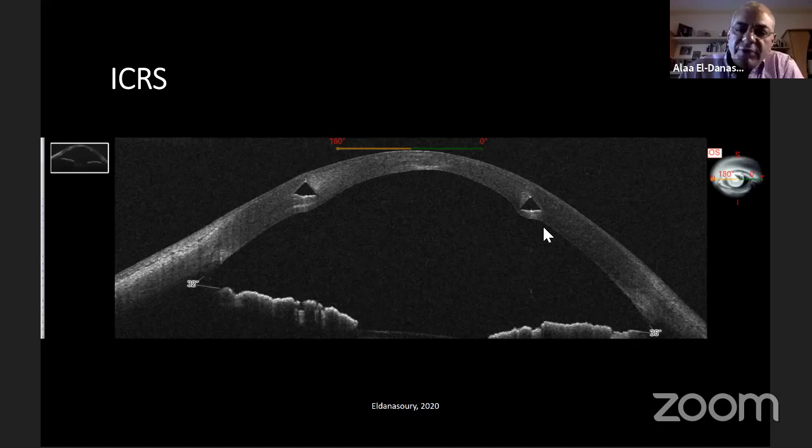In this case, for example, you can tell that the surgeon here, which is myself, did not do a good job, because the ring is kind of superficial as compared to the other rings. So in order to achieve good results, you need to have symmetrical placement, like in this case, for example. Now, but what I want to draw your attention to is something different today.